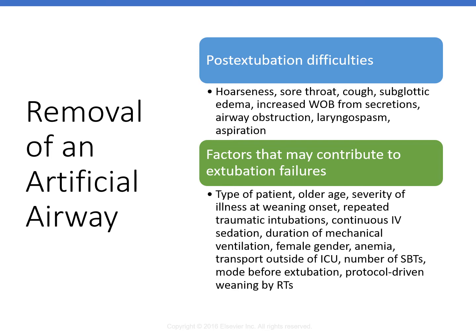So usually this is treated with some cool aerosol or even nebulized racemic epinephrine, that 2.25%, 0.5 mLs, 3 mLs total, right? You can use Heliox, a 70-30 mixture, or you can use it through a non-rebreathing mask, or you can even use CPAP too, right, to help stent open that obstructed airway or that upper airway that's narrowed, right? So those things could help reduce work of breathing through that partially obstructed airway.